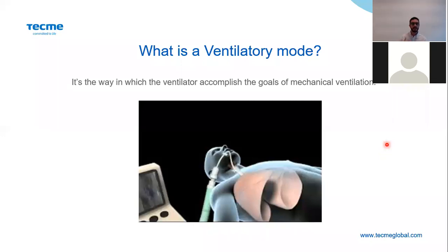So what is a ventilatory mode? A ventilatory mode is the way in which the ventilator accomplishes the goals of mechanical ventilation.